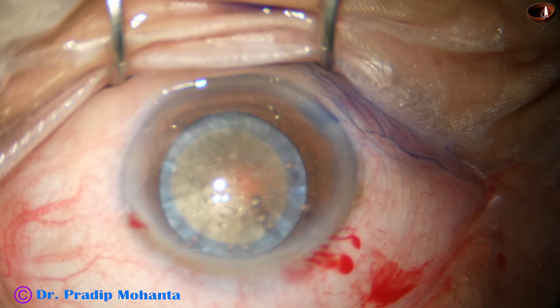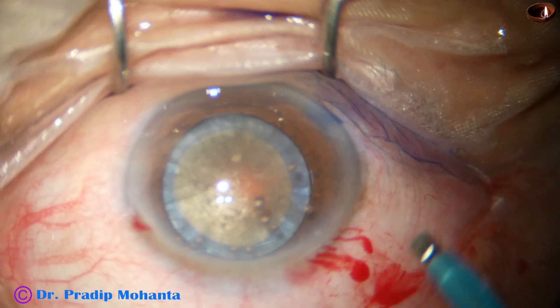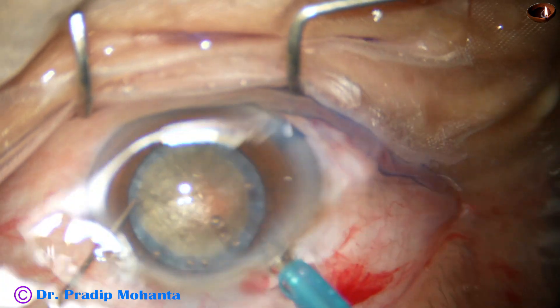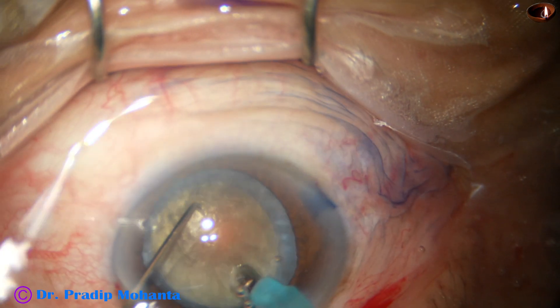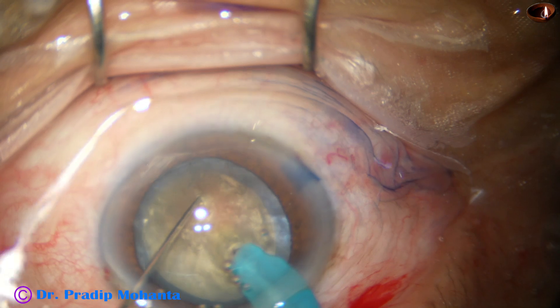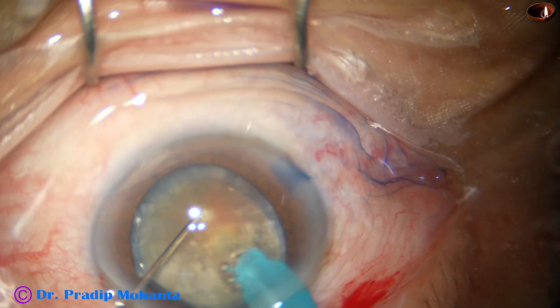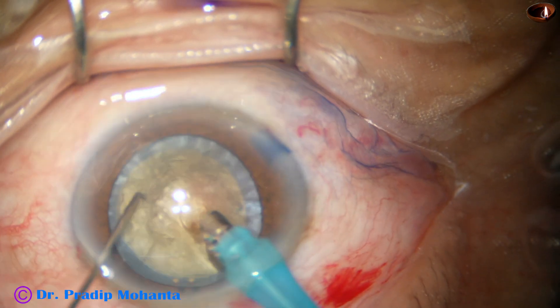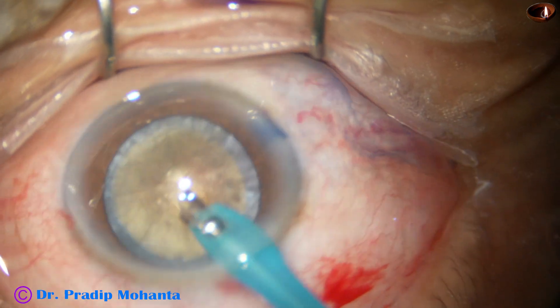Now we find that the nucleus is quite hard — about grade 4 nuclear sclerosis. I am trying to crack the nucleus by my technique, Mohanta's submarine chop. I am making a tunnel with bevel down because this is a free-floating nucleus. Then I use reflux and come out. Now I turn the handpiece and make the bevel off.